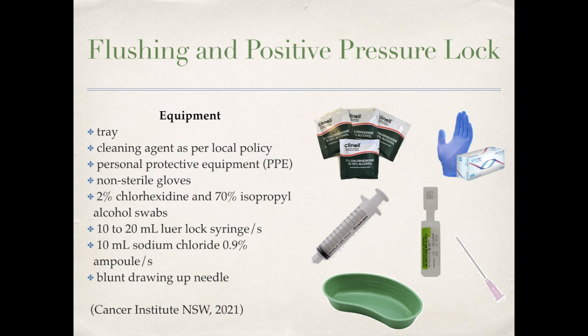You'll also need 10 ml of sodium chloride, 0.9% ampule, and this is the recommended solution for flushing a CVAD. You'll need a blunt drawing up needle to ensure aseptic non-touch technique. And if you are going to be connecting any intravenous medications or lines, just have that handy.